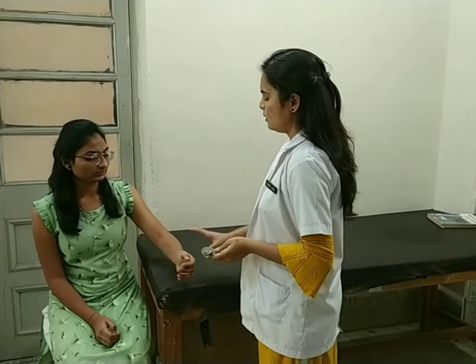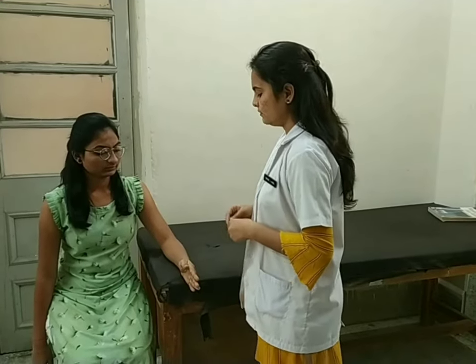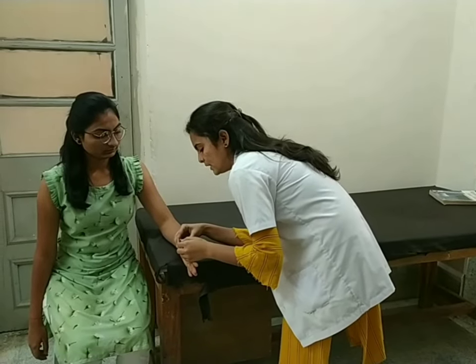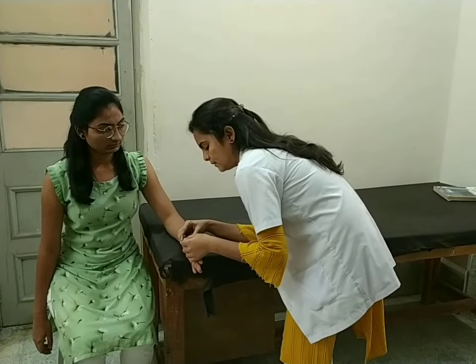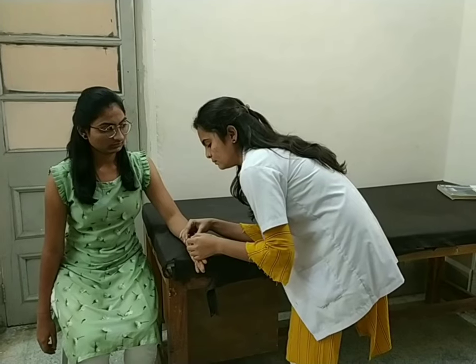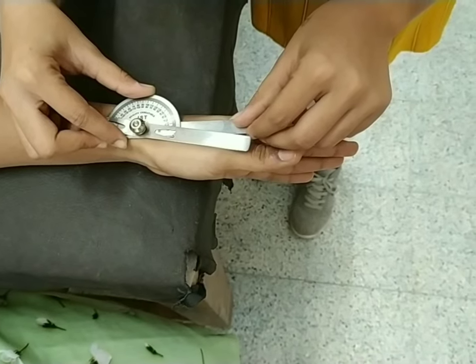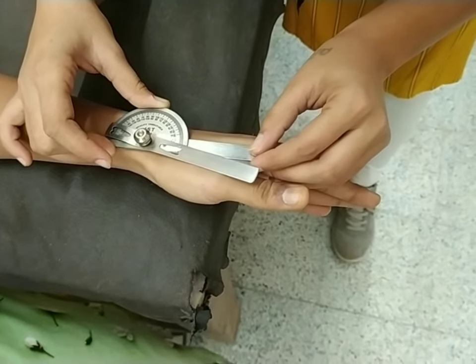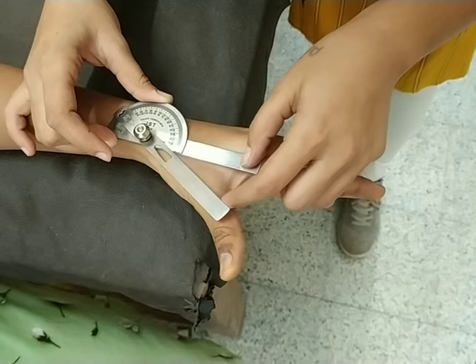For carpometacarpal joint abduction, position of the patient sitting on a chair with forearm and palm fully resting in mid-prone position. Fulcrum over the lateral aspect of the radius. Stable arm over the lateral aspect of the second metacarpal and moveable arm over the lateral aspect of the first metacarpal. Ask the patient to move your thumb towards your palm in a horizontal plane. Normal range of carpometacarpal abduction is 0 to 70 degrees.